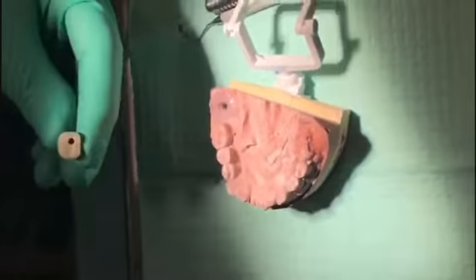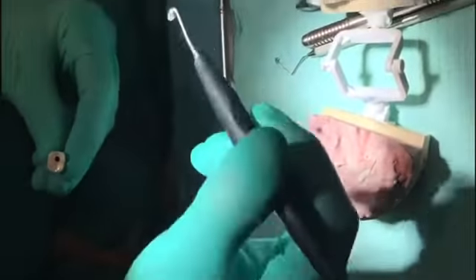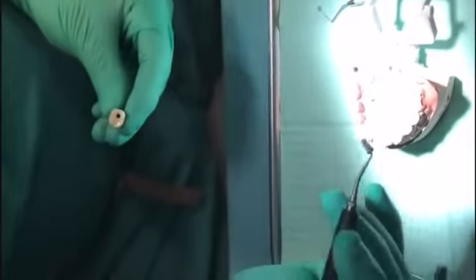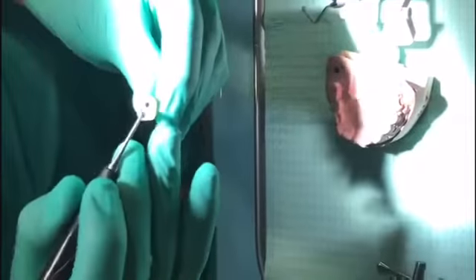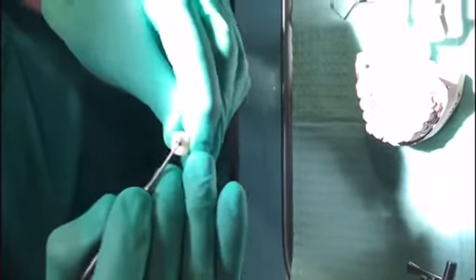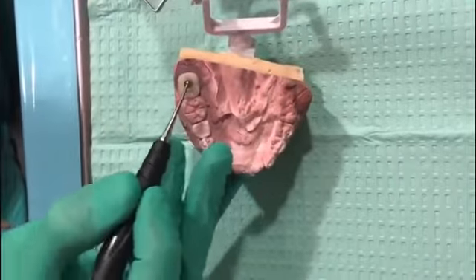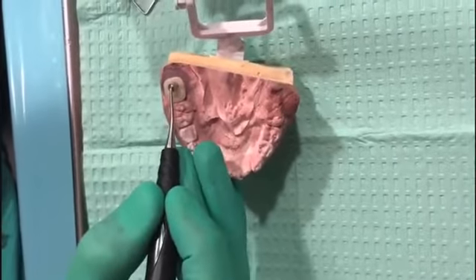So we've created a very special tool called the cross-level abutment holder from Helmut Zeff. This is used to engage your abutment or crown just like this, and when you go to the mouth it's much easier to finesse it and engage the hex, so you don't have to fight with your fingers and risk dropping things.